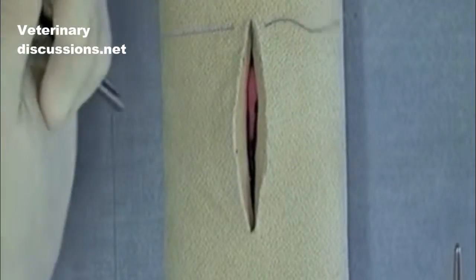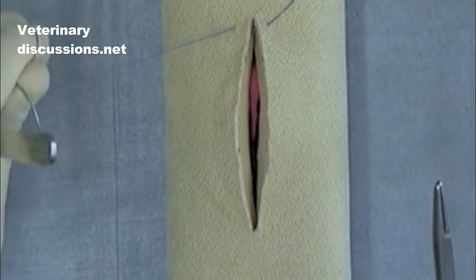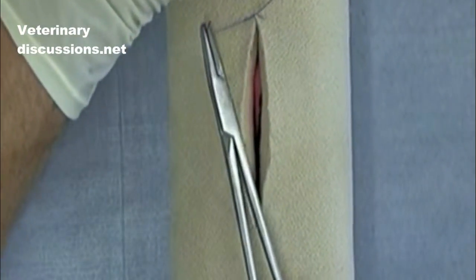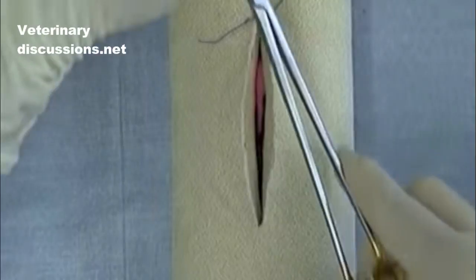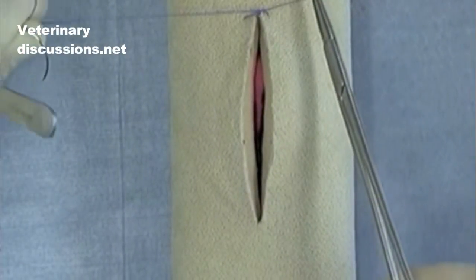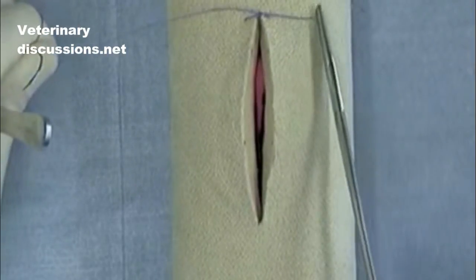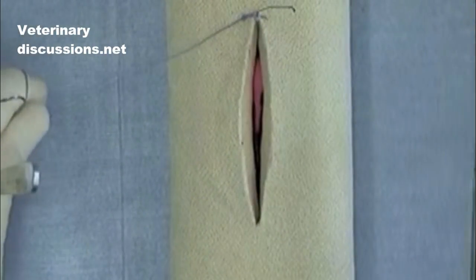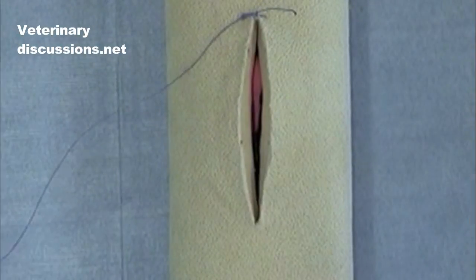This is the way I would recommend beginning the suture patterns of many of the continuous sutures we will be doing in this course. I'm just putting one square knot to complete this simple interrupted suture.